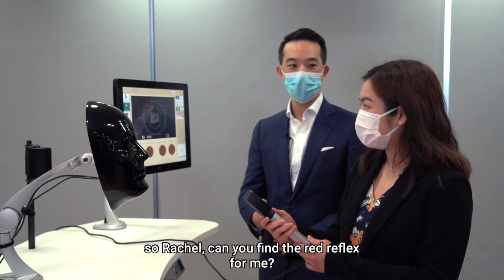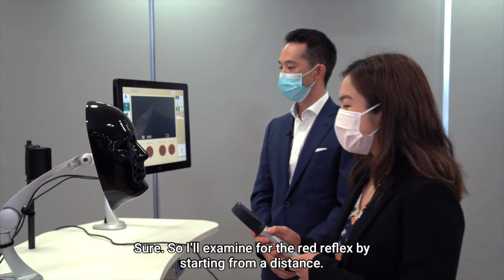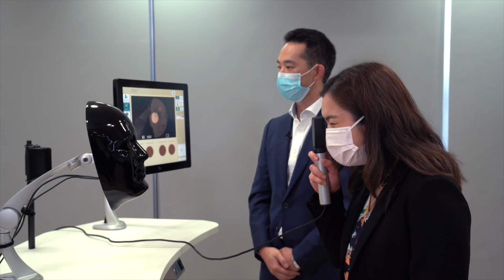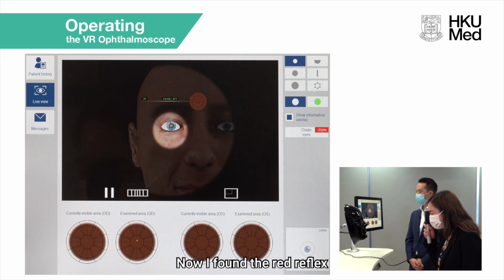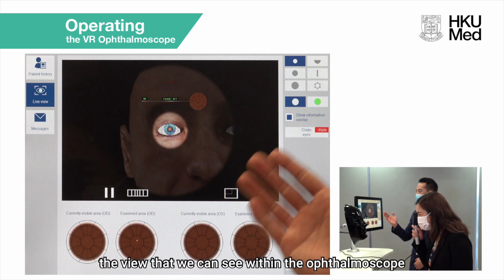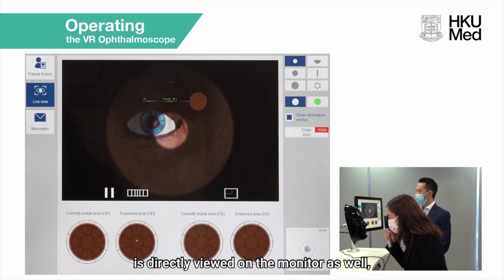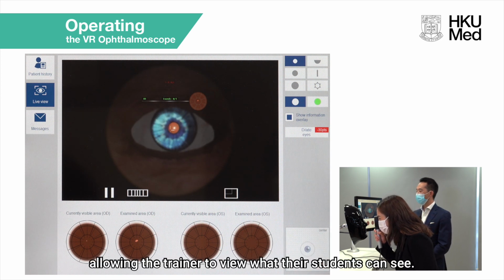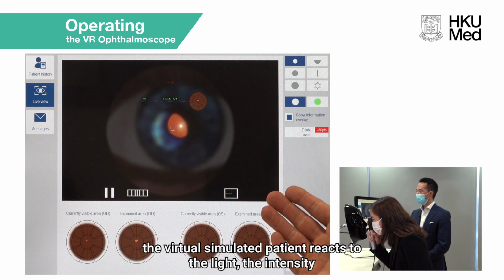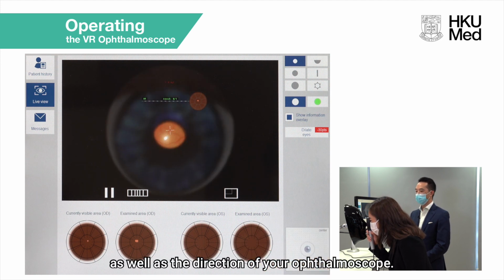So Rachel, can you find the red reflex for me? Sure. So I'll examine for the red reflex by starting from a distance. Now I've found the red reflex, and I'll gradually approach the patient. And as you can see, the view that we can see within the ophthalmoscope is directly viewed on the monitor as well, allowing the trainer to view what the students can see. And you can also notice that the virtual simulated patient reacts to the light, the intensity, as well as the direction of your ophthalmoscope.